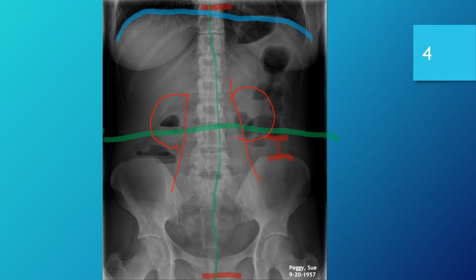Number 4, is it free from artifacts? Yes, it is free from artifacts. One thing in terms of anything that would be detrimental to the image, one thing that I would like to point out, something you may not have seen initially, here in the corners, right in there, and then of course right over here. If you look, I'm going to take those off real quick so that you can see it again. I just wanted to bring your attention to that area.